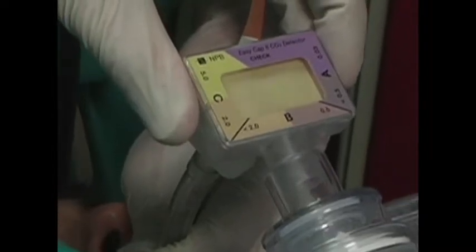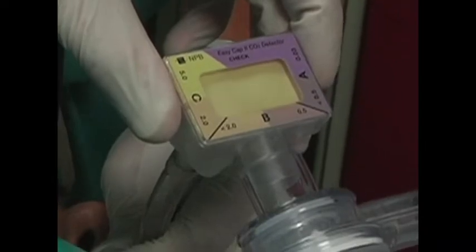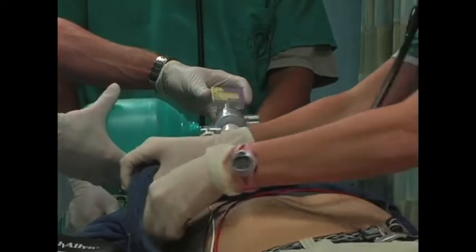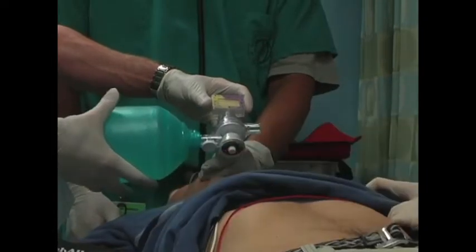Color change confirms correct placement. The epigastrium is assessed for absence of sounds, and breath sounds are assessed for side-to-side equality.